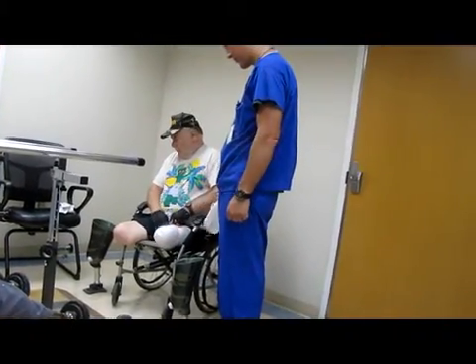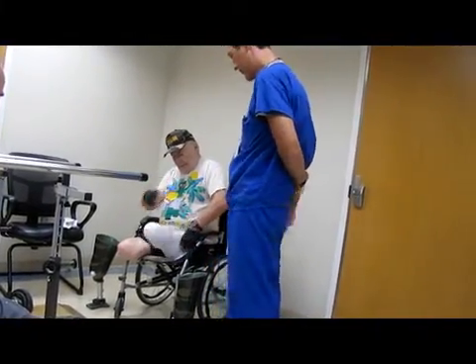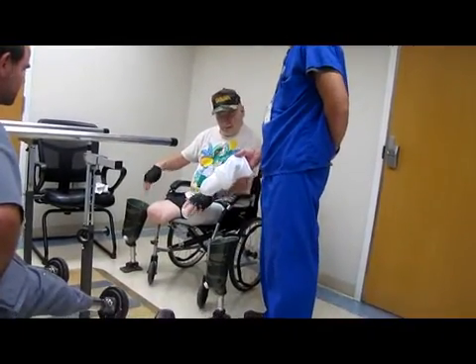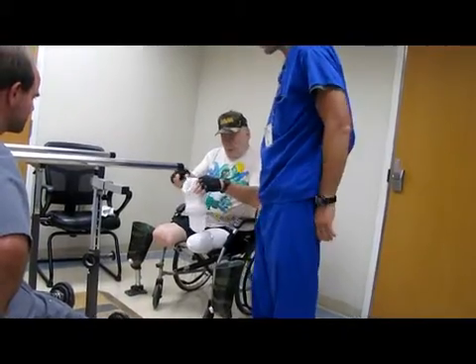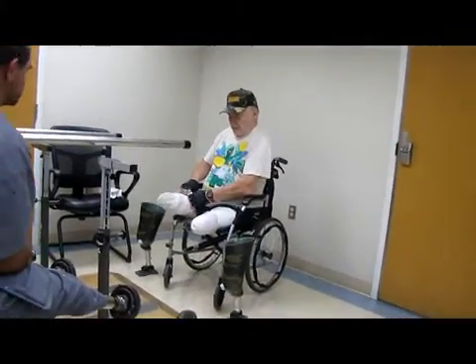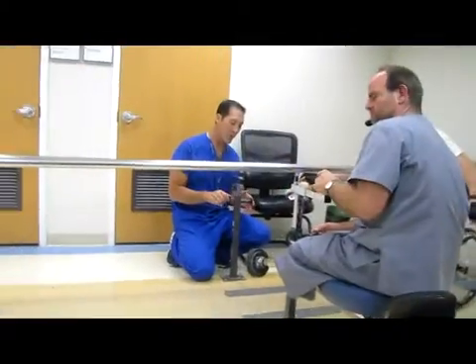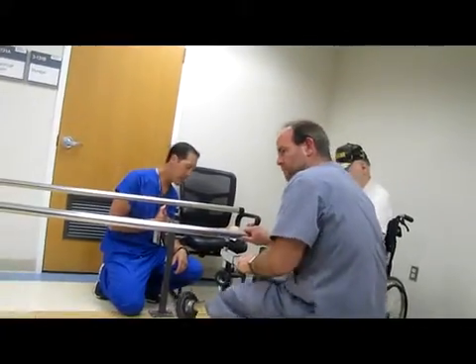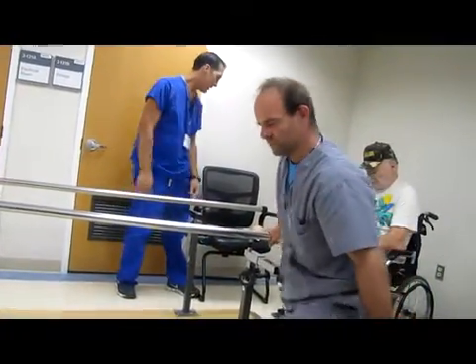You know, for the old leg you gave me, and I have it in the bag there, one of those falsy rubber things to put in the bottom. Would that be acceptable to use in these things just as a pad at the end? Well, then we'll incorporate it. What are those called, by the way? A distal end pad. Distal.